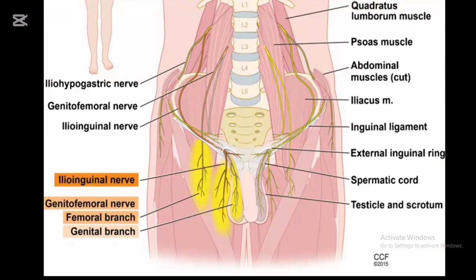If inguinal surgery is planned, then you should know that for inguinal surgery, not only do you need to block the ilioinguinal and iliohypogastric nerves, but also the genitofemoral nerve. So for that, first you will perform your block and ask the surgeon to just carry on with the surgery. And as soon as the surgeon reaches the spermatic cord, just request them to inject 1 to 2 mL of local anesthetic into the spermatic cord area. And then there you go, the genitofemoral nerve will be blocked and surgery can be performed.